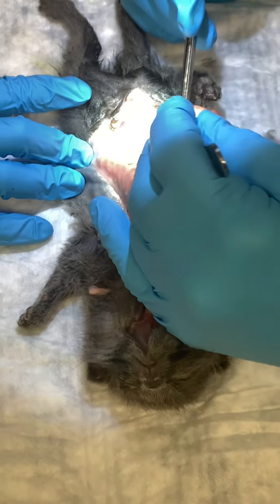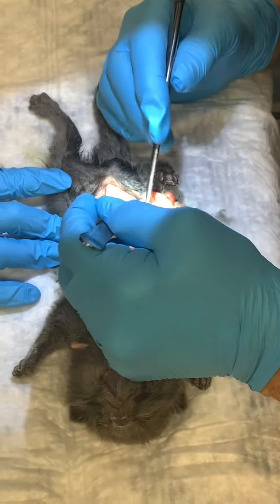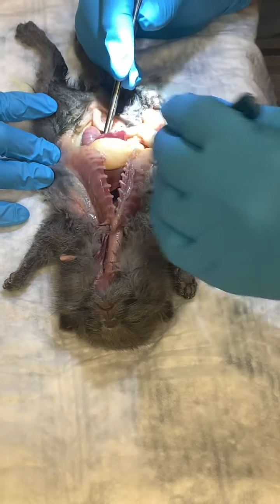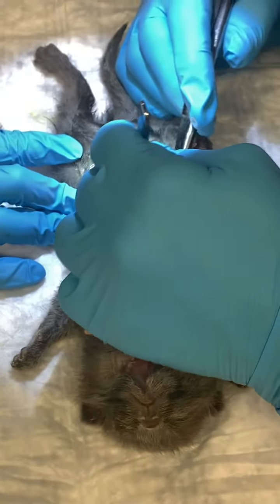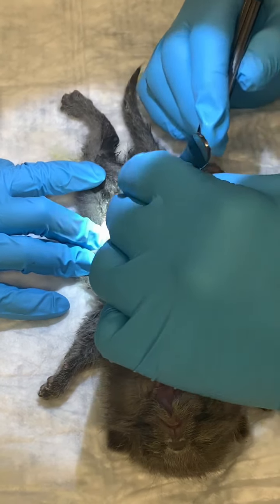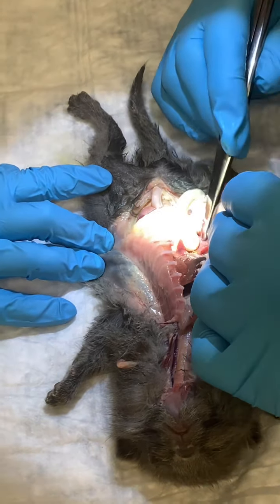Yeah, because it turns into the large intestine. There's the spleen right by the stomach. And then there's some pancreas. There should be pancreas. That's the left branch.